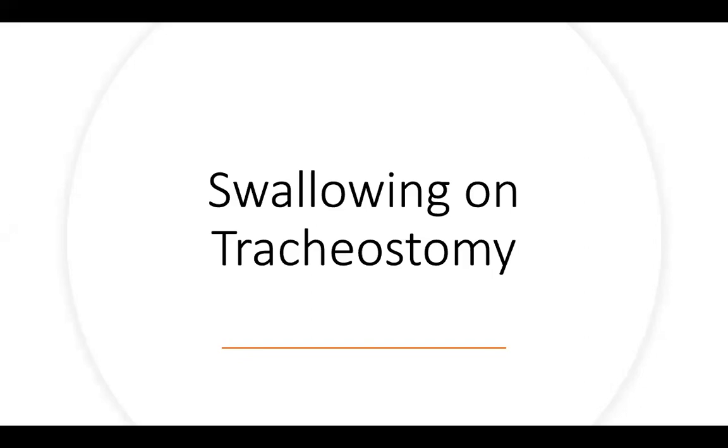It's not there continuously. It's probably because if secretions have accumulated, the patient would have difficulty voicing. If he doesn't have secretions, then he would have more space for the air to escape around the trach. So if his airway is large enough compared to his trach, and it's allowing air to escape to the upper airway, then they can speak without a speaking valve.